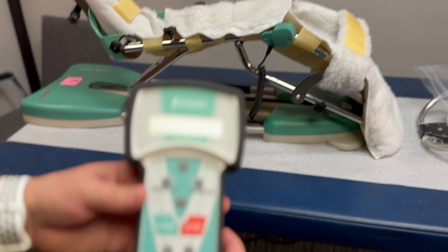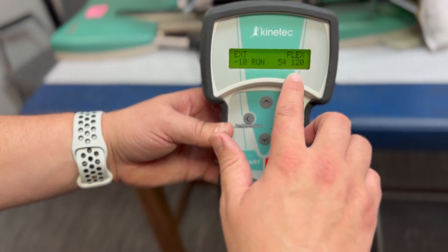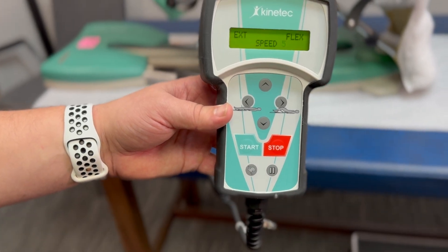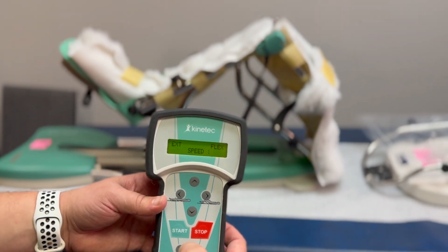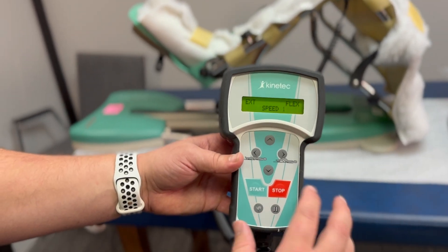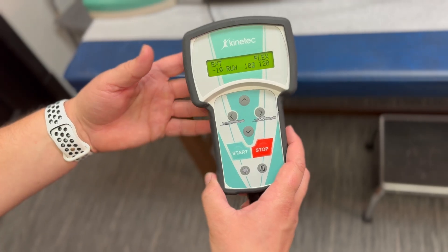Other things to take note: the number that is constantly moving is the degree that you are currently at as the CPM is moving. 120 on the flexion is completely bending. You also have a little rabbit icon that adjusts the speed — you have five levels of speed. The slower you go, the less painful sometimes. Or sometimes you can just go ahead and max out the speed per your preference. That is how you control the device.